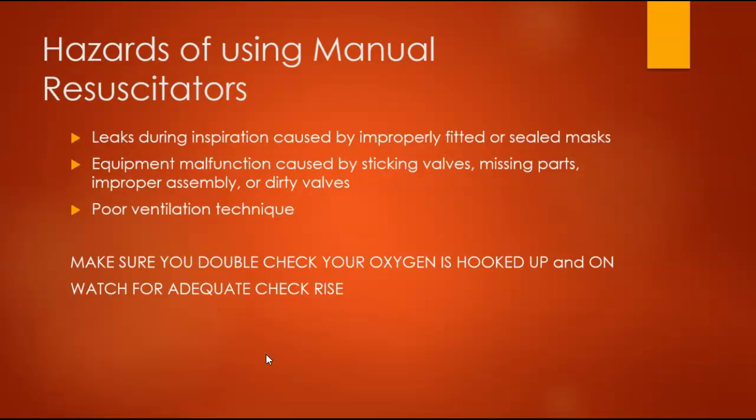Medical emergency codes are messy. If you guys have watched one yet, they're messy and they're dirty. A lot of times, because I'm a weirdo, I will always carry bacteria filters with me, and I put bacteria filters on my bag so that whatever's coming up from the patient isn't getting into my resuscitation bag. It goes into the bacteria filter. I can throw the filter out, put a new one on. We're good to go.